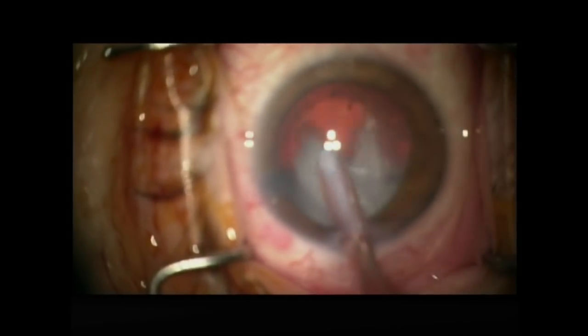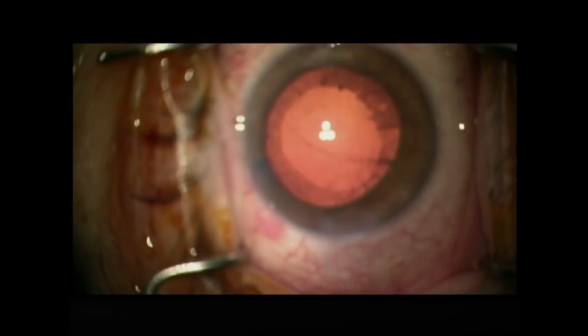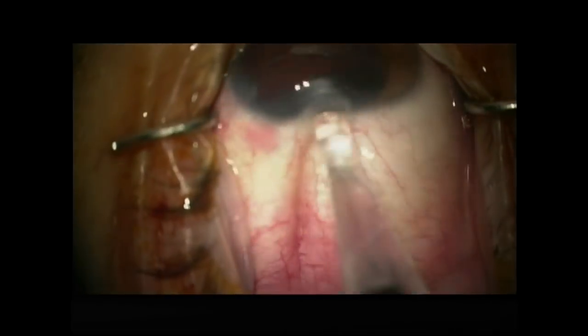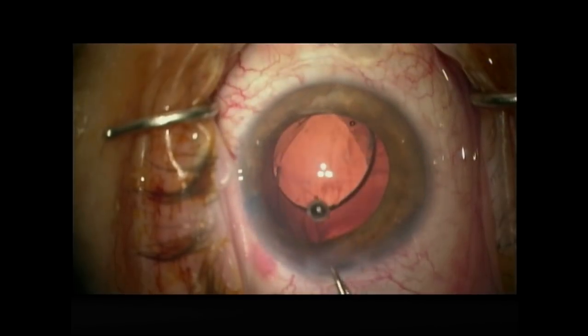In general, it is usually unwise to aspirate in the vitreous cavity as you can never tell if there is any remaining vitreous. However, this patient did not have any consequences from this as he had already had a complete vitrectomy from prior. However, in retrospect, this should probably have been avoided.